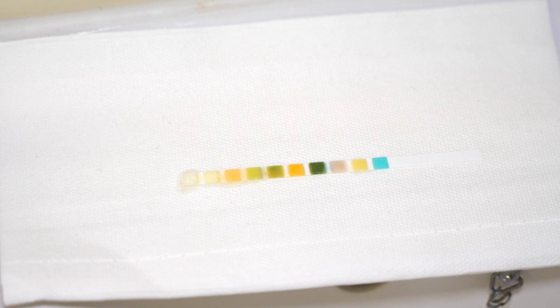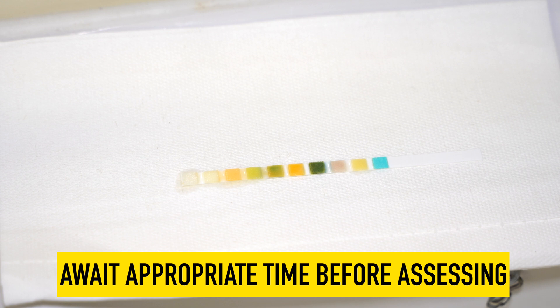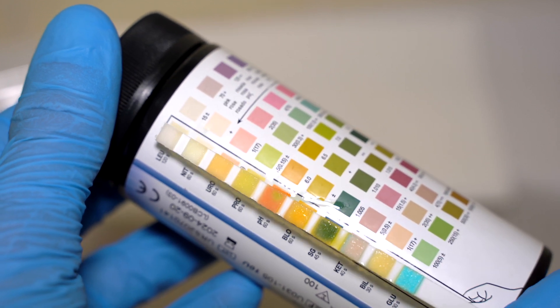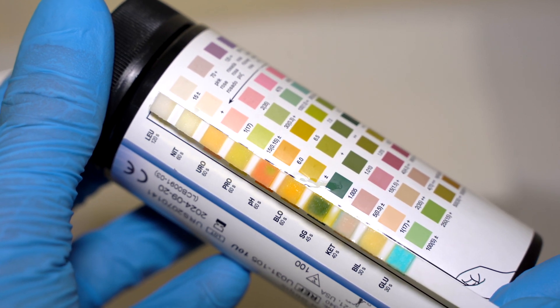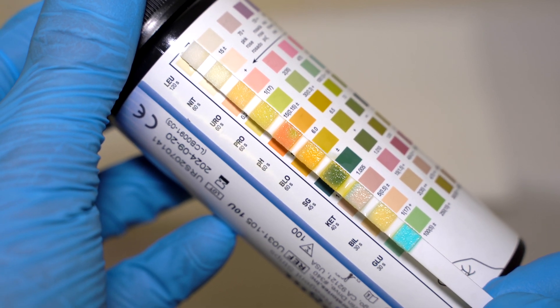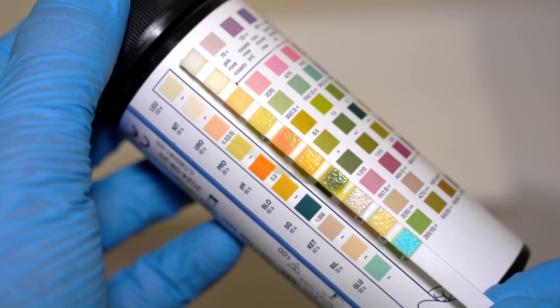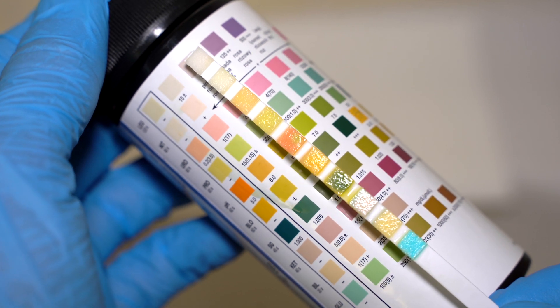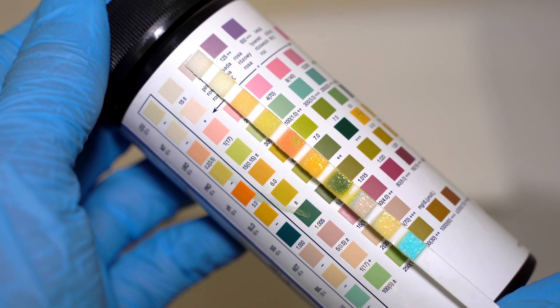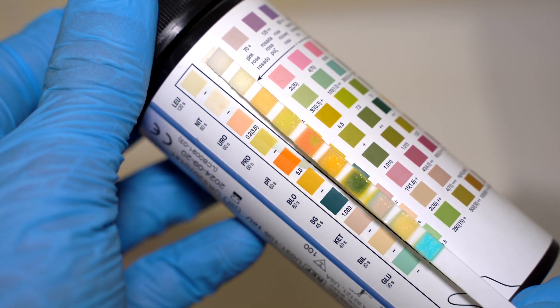Having done the urine dip, we're going to place it on a piece of paper towel to make sure we don't get any horizontal contamination between the reagent strips. Once we get the excess urine off the strip, then we can compare it to the urine bottle. Even if we've been incredibly careful not to spill any urine, you can see why it's very important to use gloves, because you're going to apply the strip that you've used with the wet urine to the side of the bottle.